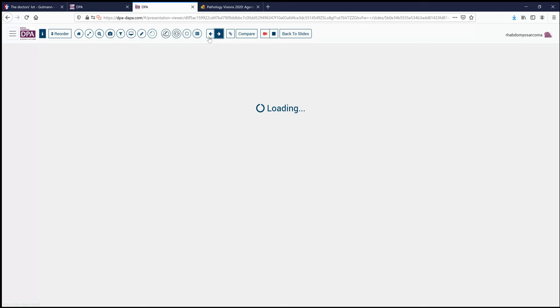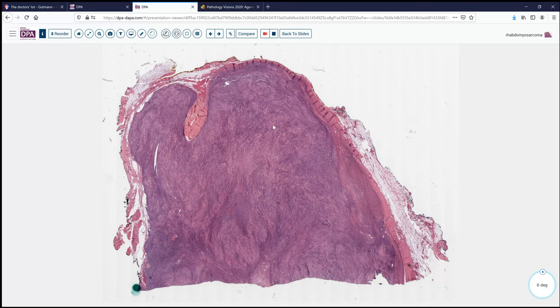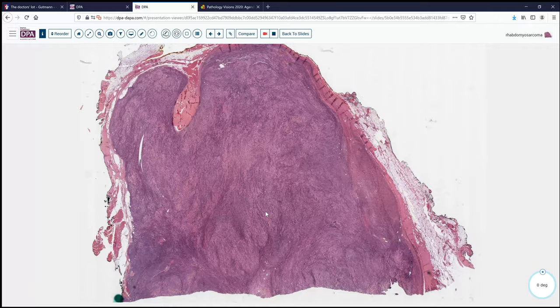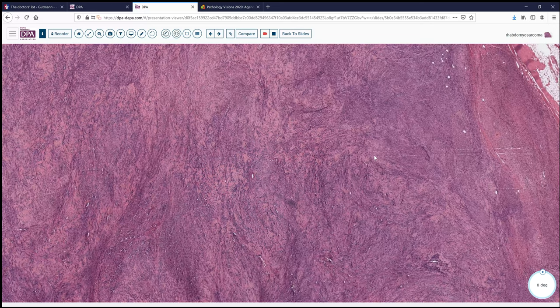Here is a nice representative section of this tumor, which at low power shows a prior biopsy site and a nicely encapsulated area with fairly sharp and distinct margins. It is a fairly blue-appearing tumor with some hyalinizing areas. We don't see any immediately involved skeletal muscle; it seems to be in the fat.